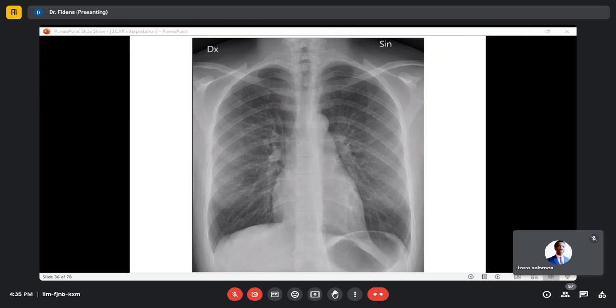It's very fast done. So which one are you going to choose to use? The second one. The second one is the easiest one. Okay? Yeah, it'll be easy.